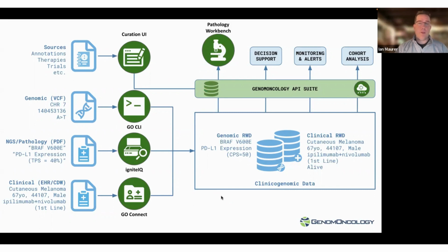Our pathology workbench is our oldest product. It's been around for almost 9 years now, and that helps pathology labs take data off of a sequencer, validate the quality and the variants, interpret the variants, and interpret the whole case to then generate a custom white label report with their logo and colors and really their demonstrated interpretation.